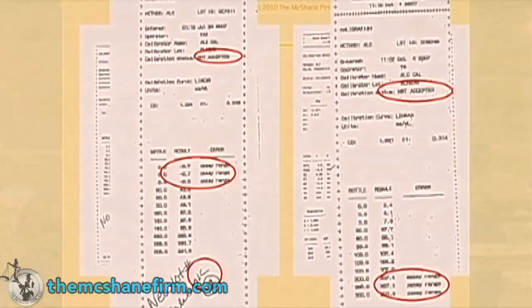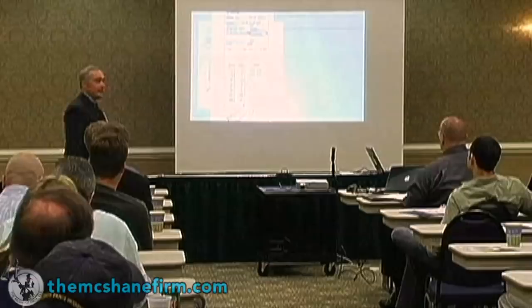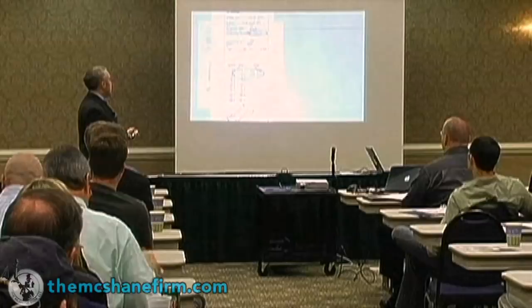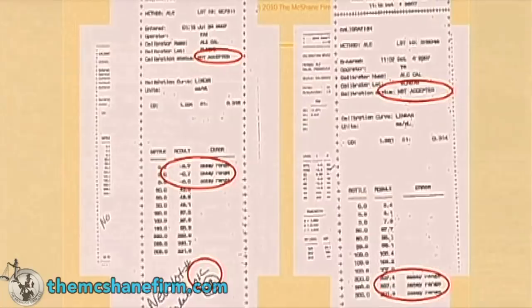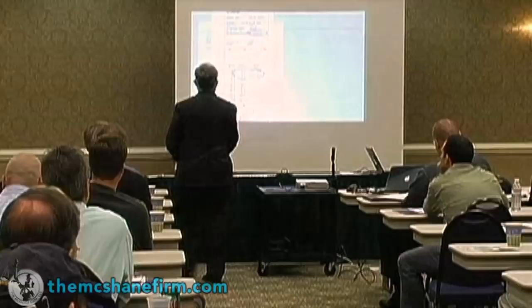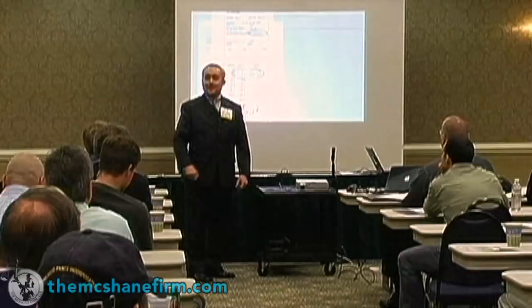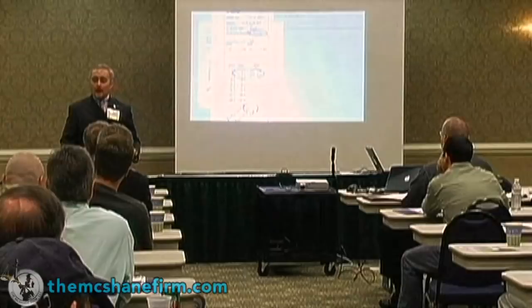Calibration status: not accepted. Who in this room would think that means the thing is okay? You don't need a PhD in analytical chemistry to say if something isn't calibrated, it isn't working right. But then you look a little further down — I didn't know what this meant at first, but I learned. You have negative numbers. If you're measuring alcohol, zero means nothing is there — how can you have a negative value? And it even says right there: 'error assay range.' But the analyst signs off on it anyway.